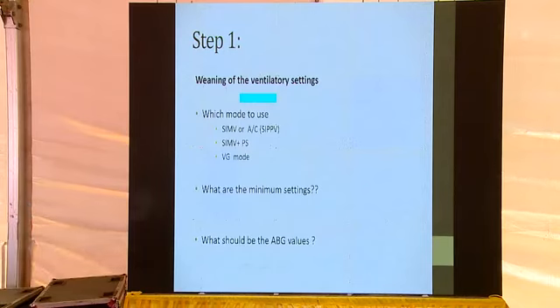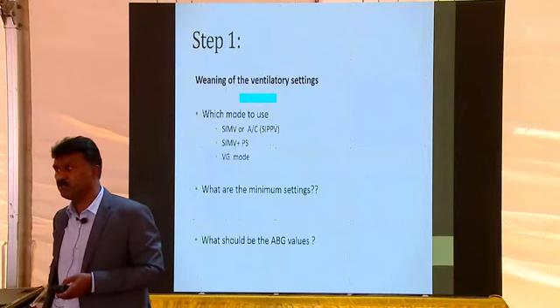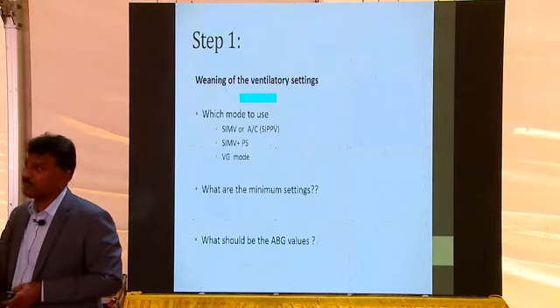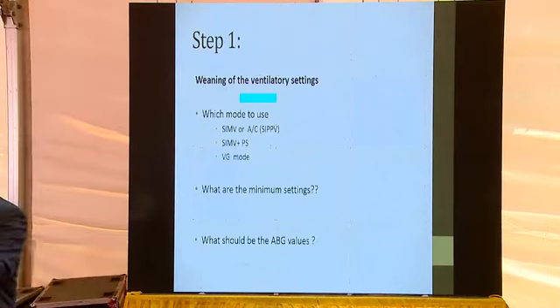Not very sure whether it does a good job, whether we can give pressure support alone. Switching on to pressure support is like switching off SIMV completely, which you can maybe try. Personally speaking, I haven't tried whether you want to switch off. It is going to be a little risky.